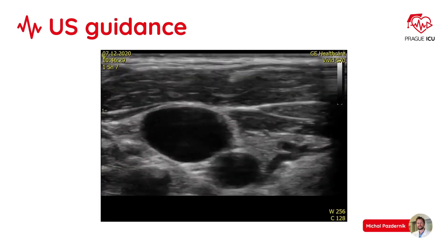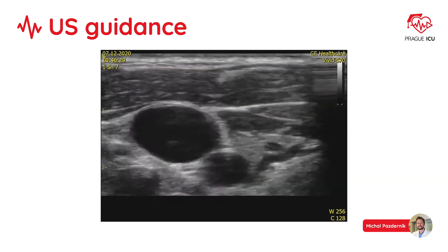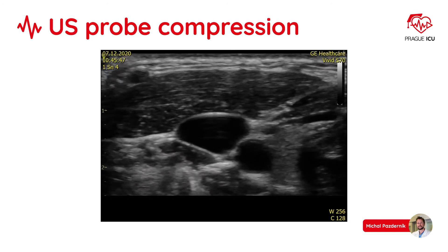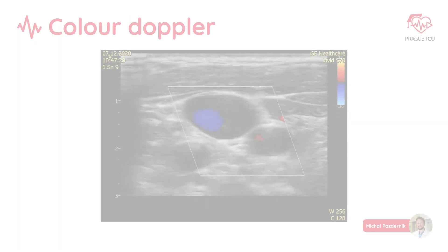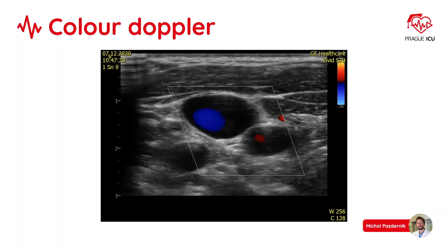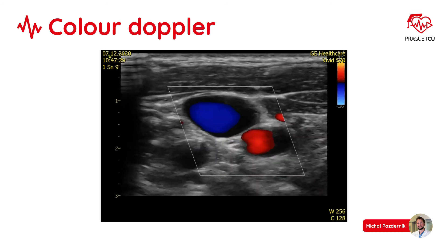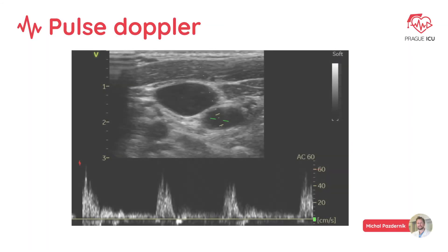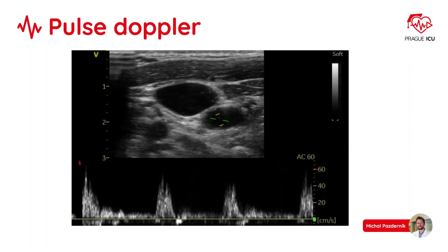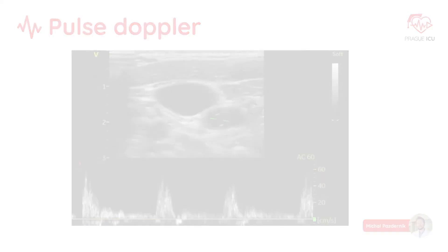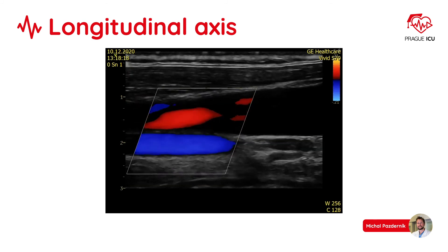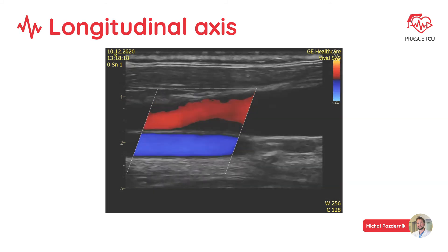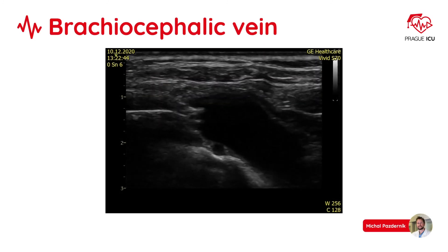On ultrasound in 2D, the vein is larger and oval. The vein can be nicely visualized as a compressible structure, compared to the artery which is non-compressible. Color Doppler shows an overview of the direction of flow in both vessels. Pulse Doppler with a cursor in the carotid artery shows pulsatile flow. The longitudinal axis view shows the vein being more superficial compared to the artery. We can also tilt the probe more downwards and follow the internal jugular vein into the brachiocephalic vein.